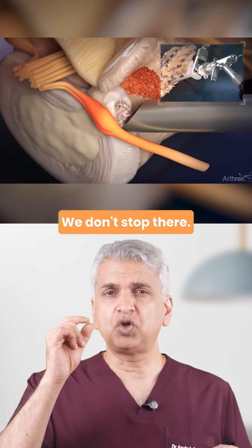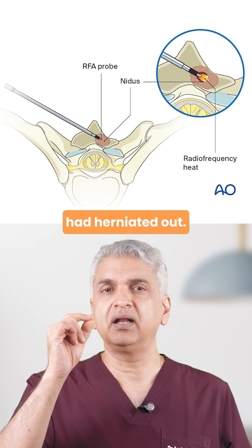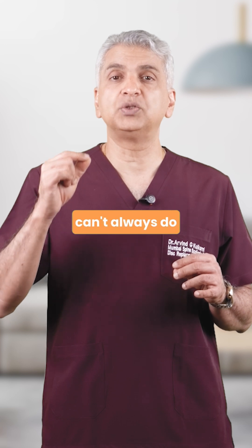We are exactly on the target. We don't stop there. Using a radio frequency probe, we weld and seal the annulus — the capsule through which the disc had herniated out. This helps in reducing the chance of recurrence, something that traditional open spine surgery can't always do as effectively.